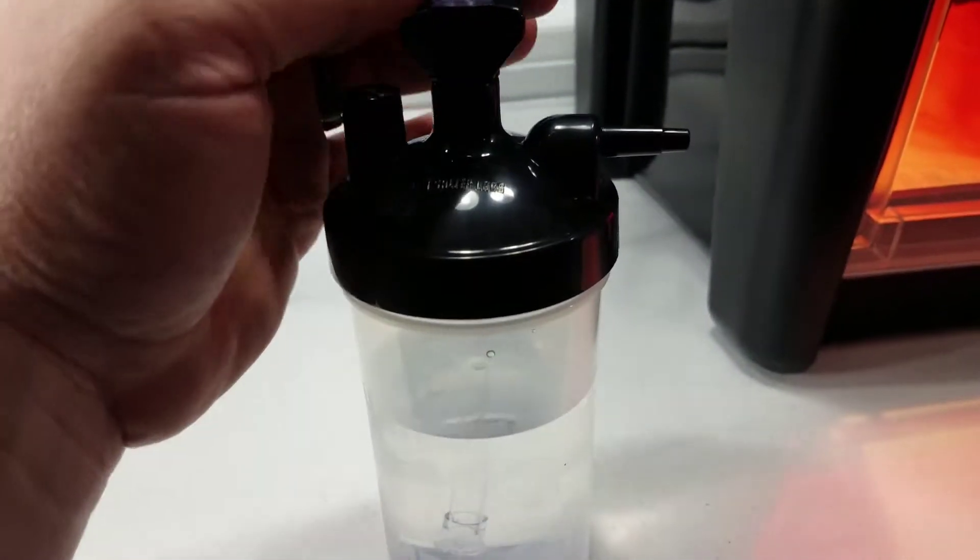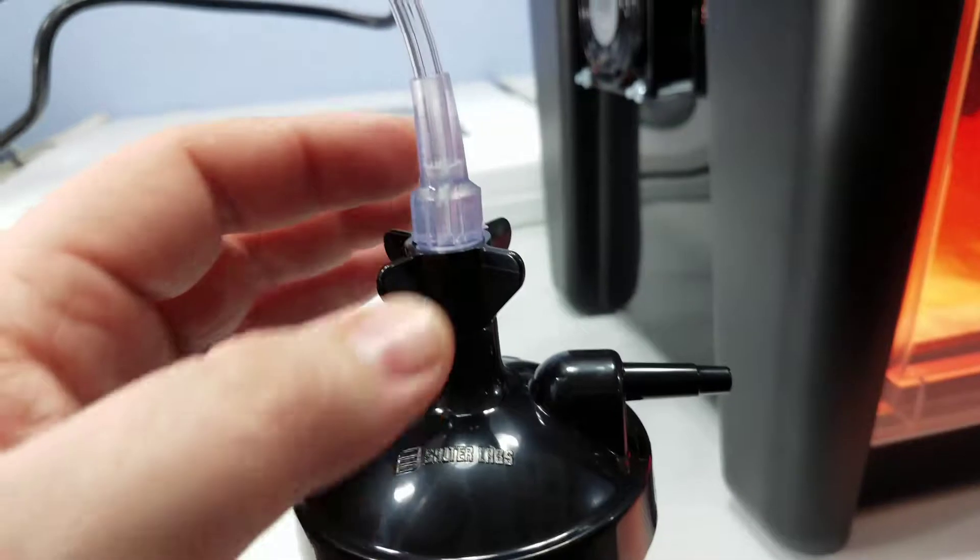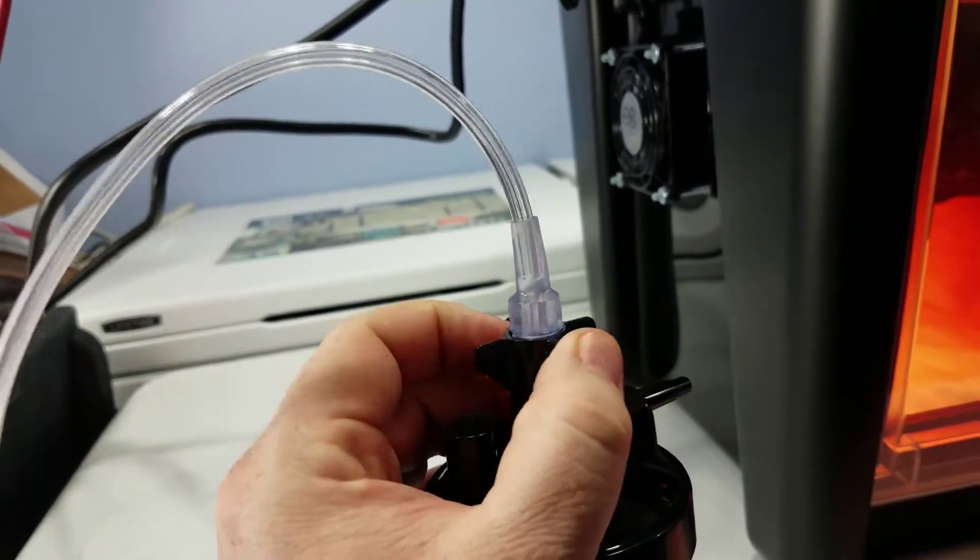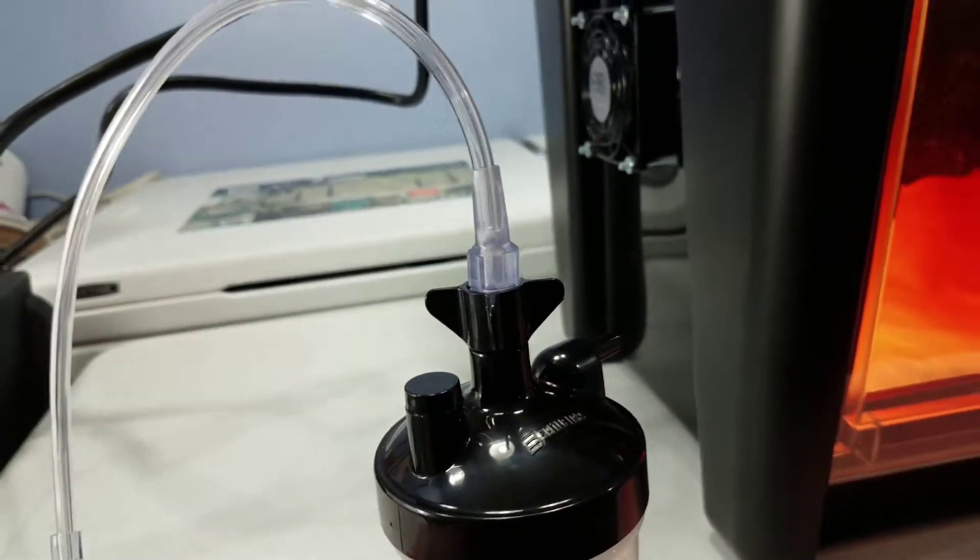Once you've got that snugged up, what you want to do is thread this into the top, that short connector. It just threads in until this goes snug and then we're gonna be ready to hook it up to the concentrator.